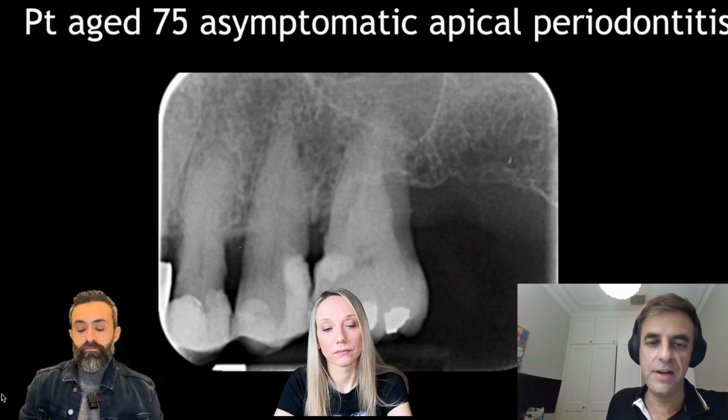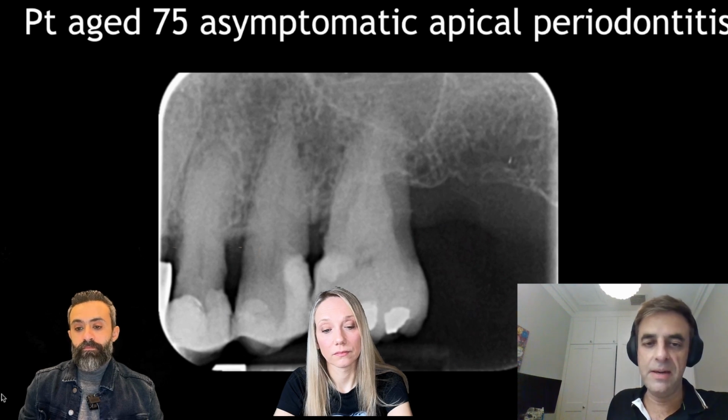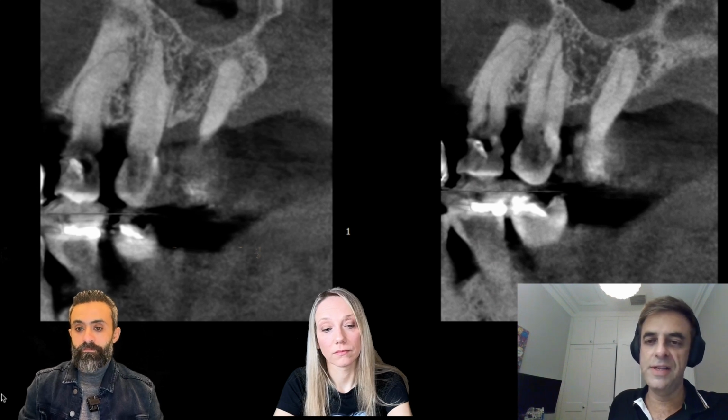But you can see I've taken a pre-op radiograph in this situation. I'm looking at the restorative margin here. I'm trying to work out how bad the caries is because he's got lots of root caries. And you can see there is a deep restoration into the pulp chamber, basically, of the upper left premolar. And if you go to the CBCT image, you see some interesting things where you can see the root is actually resorbed and the apical foramen comes out way before the root apex on the radiograph. So you're going to fill this and you're going to find that you're short on the radiograph, but that's actually the end of the root canal.